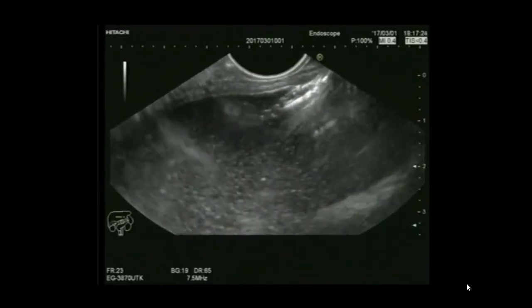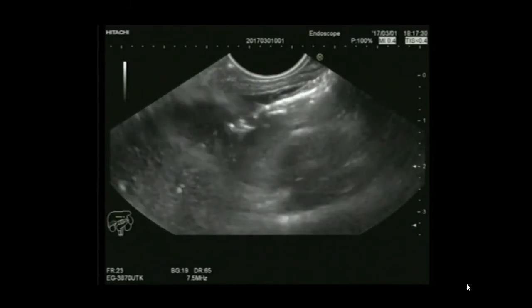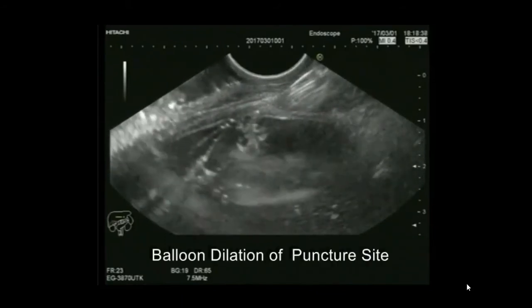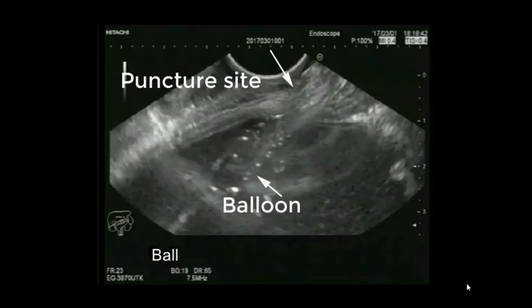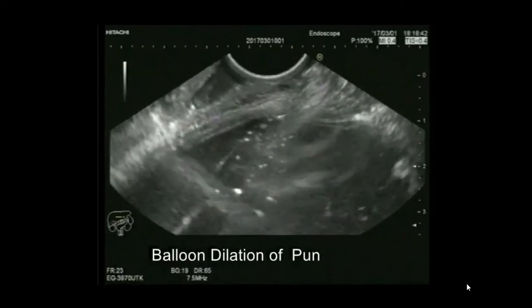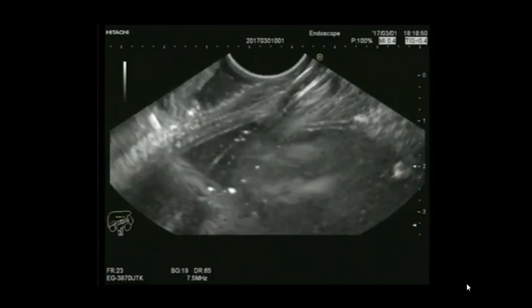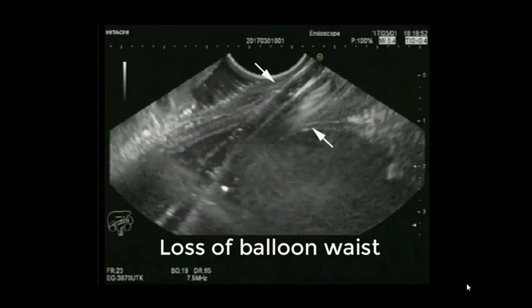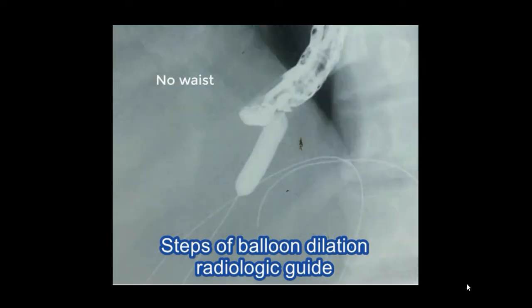We can see the balloon traversing the puncture site as it is being inflated. You can see the site of entry and the balloon during dilation — the waist of the balloon disappears after complete inflation, indicating successful enlargement of the puncture site. Dilation is confirmed by fluoroscopy before removing the balloon.